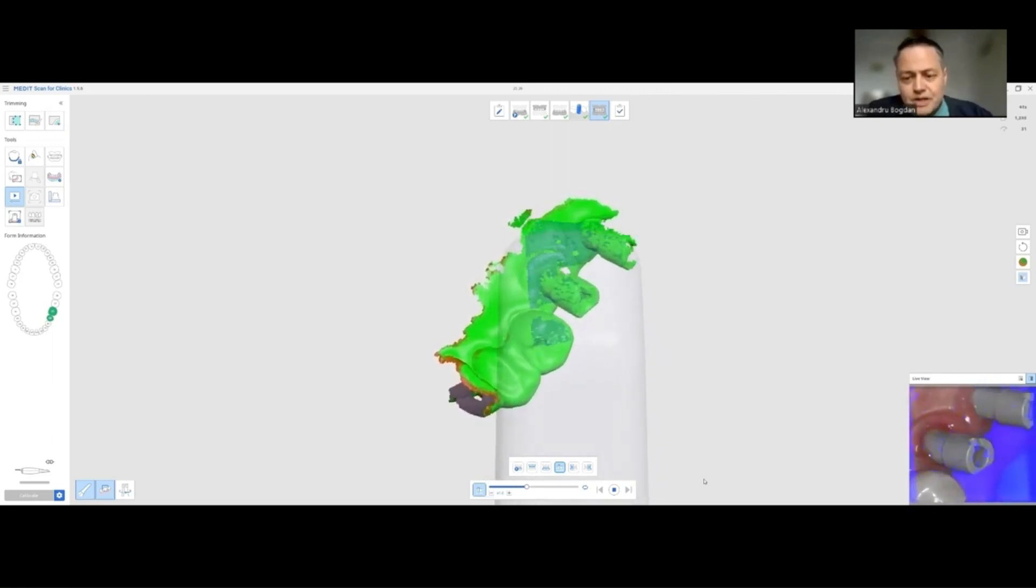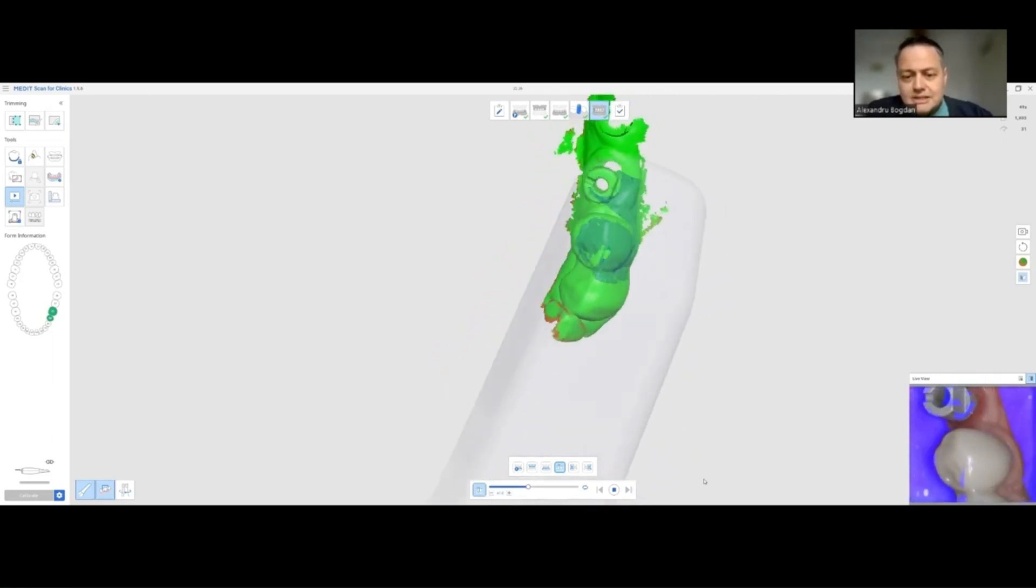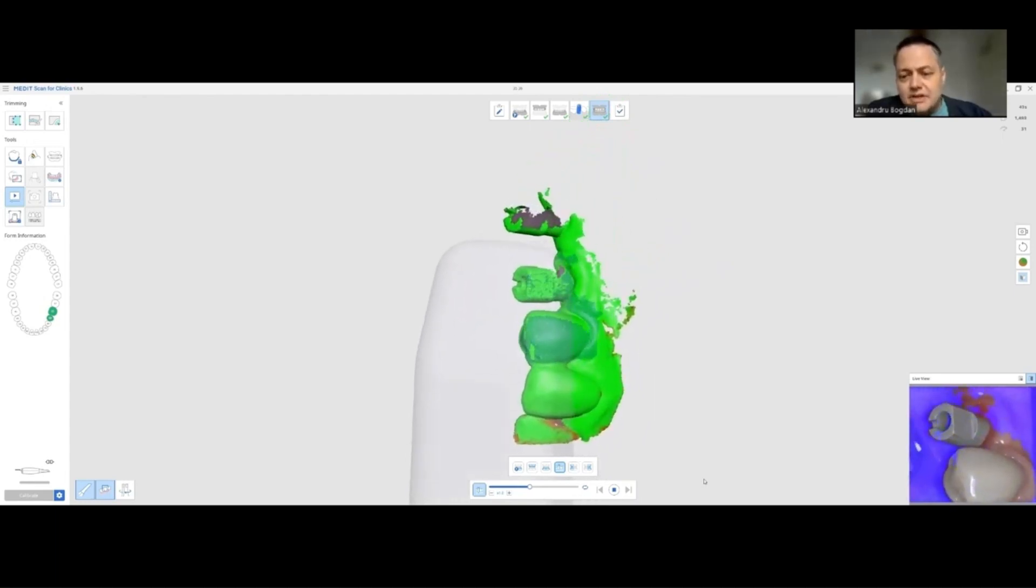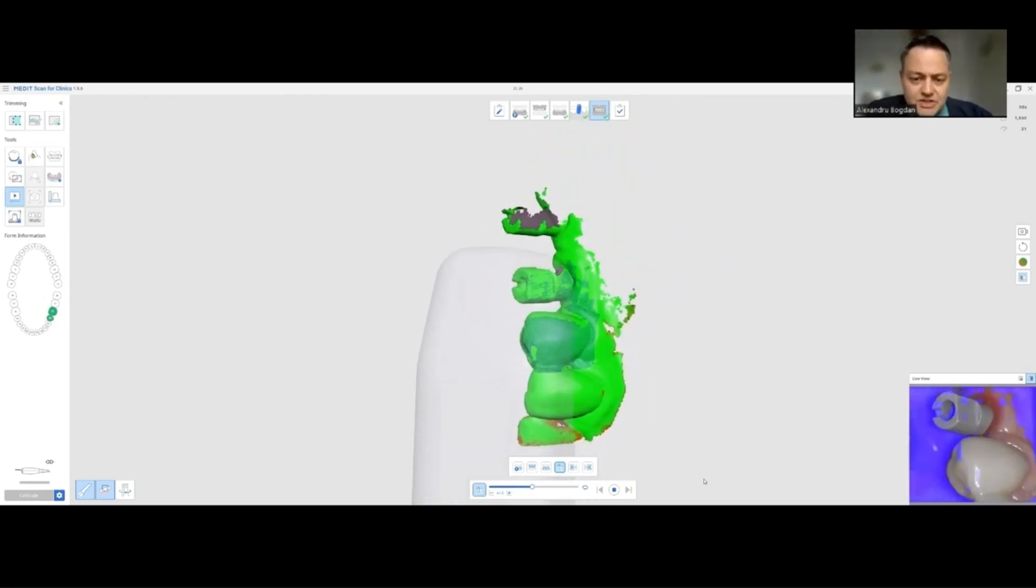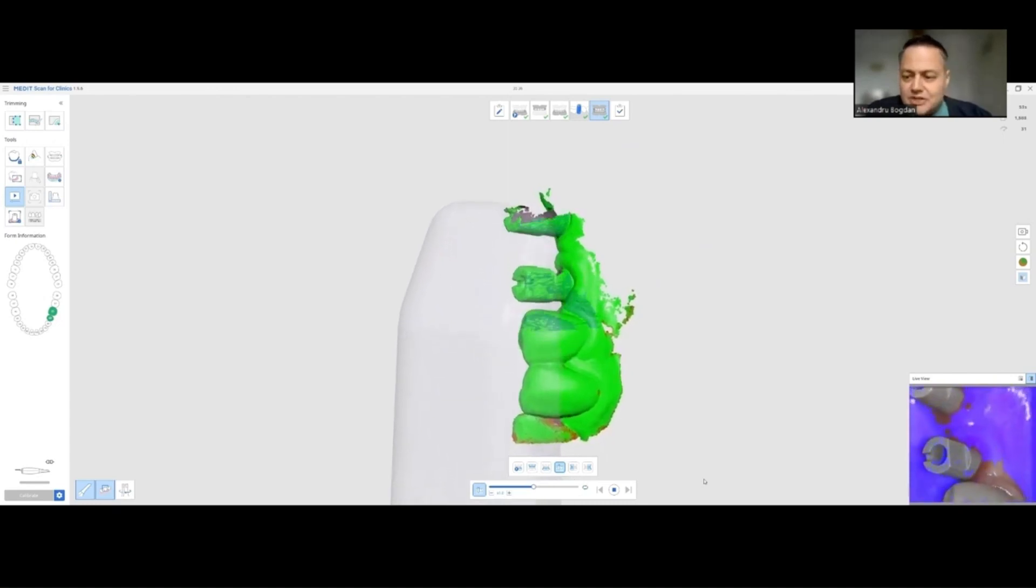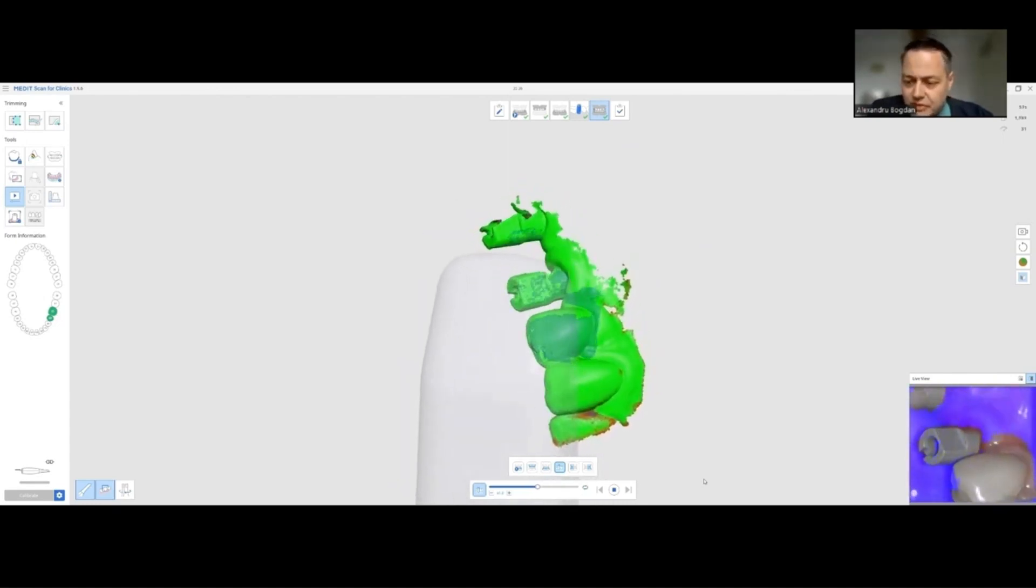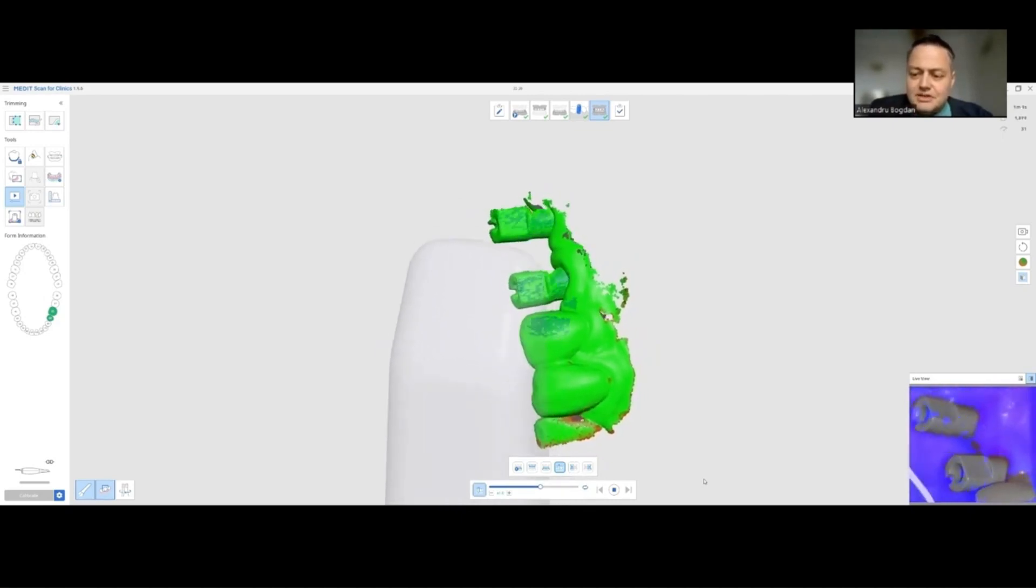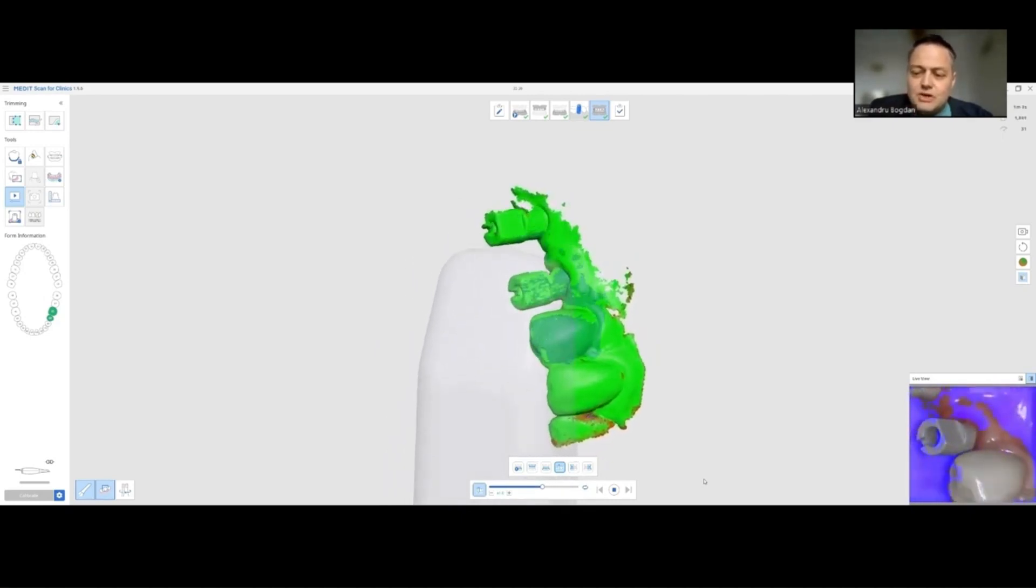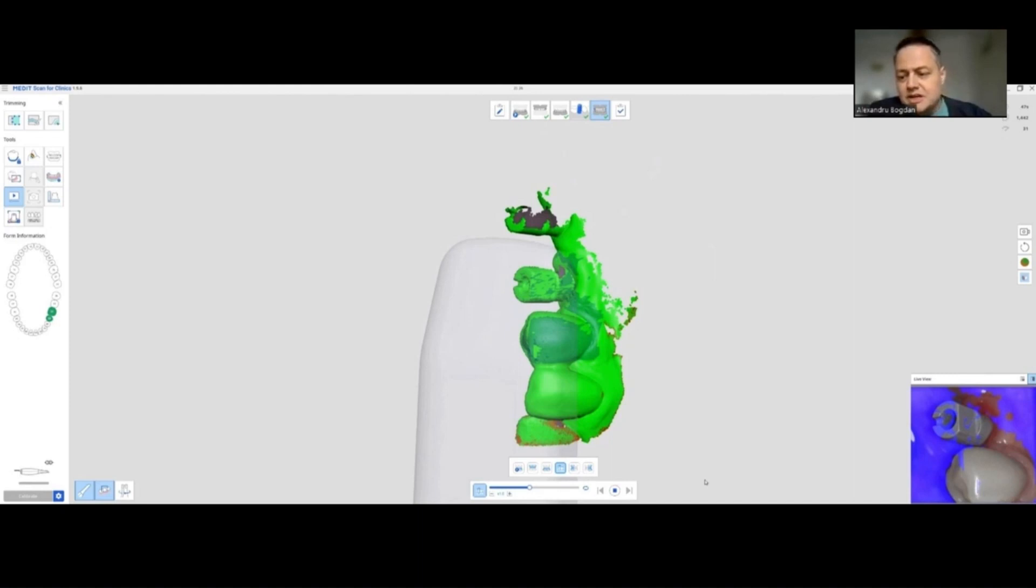Also, I try to angle the tip of the scanner to the distal going from the mesial teeth. As you can see in the scanning video, I always have part of my teeth inside the scannable area so that the scanner knows exactly where it is when it adds data. I am angling the tip of the scanner from every possible angle from the mesial to the distal.